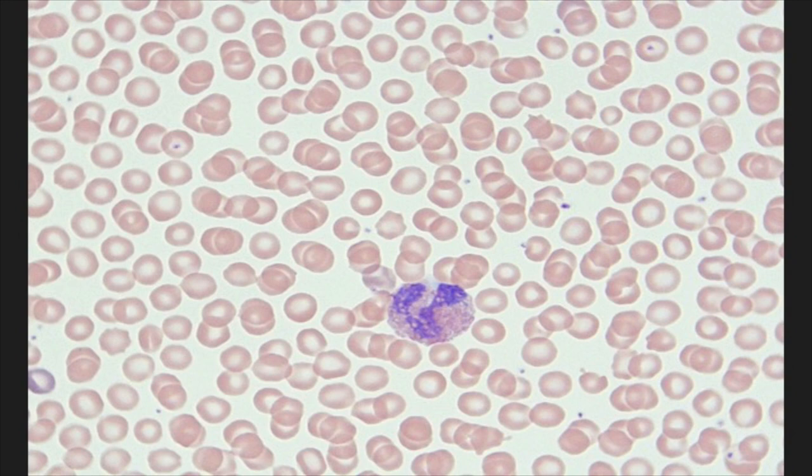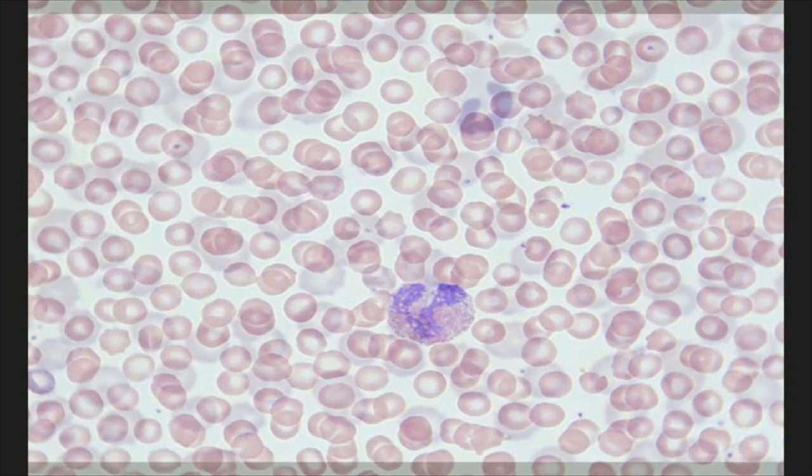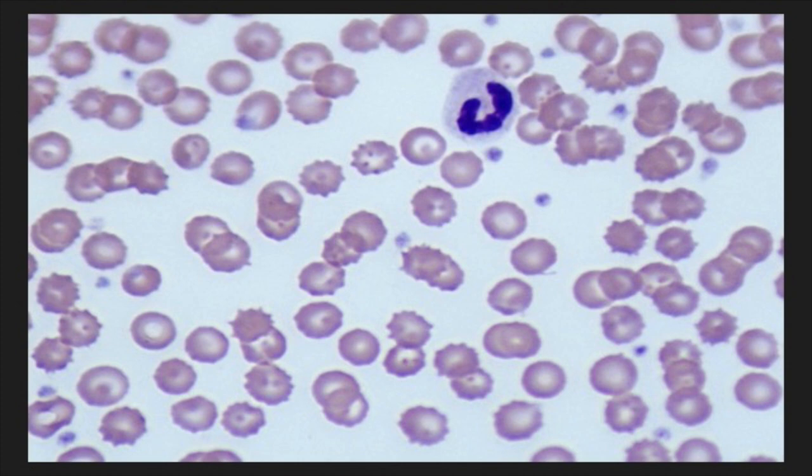We also have to take a look at our red blood cells. This is what a normal red blood cell should look like. However, there are many abnormalities to watch out for. One of those abnormalities is called crenation. The crenated cell is shriveled up with bumpy edges while the normal one is round and smooth. We have a special way of documenting and reporting crenation.